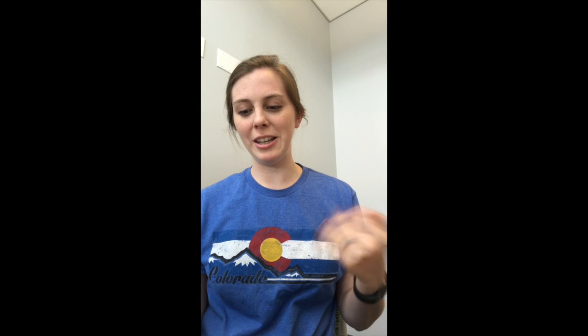Another suggestion is to use someone with thin hair for this project, or we thought even better, somebody bald. There was a PT working at the time who was bald, and we joked about him coming over because we couldn't get it to work for any of us. When we got it to work for me, I was the one with the thinnest hair, so we chalked it up to that, since they said that might be a cause.